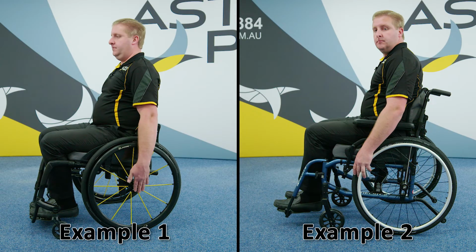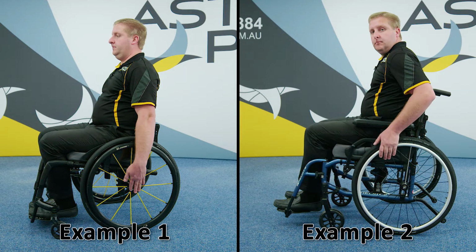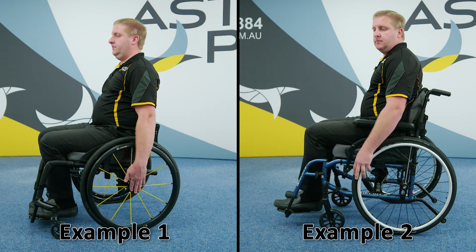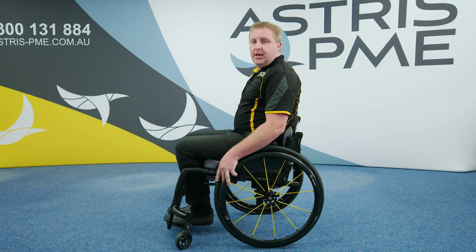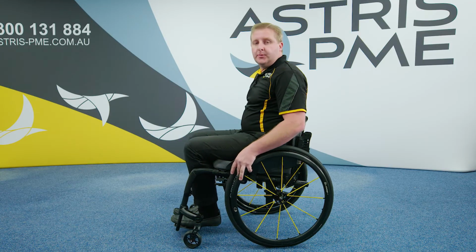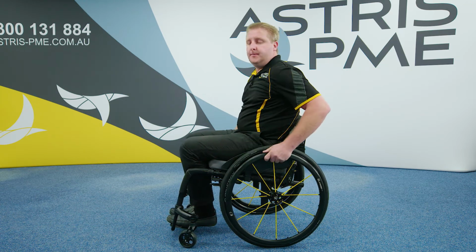The setup of this first example is this rear wheel position is in line with my trunk and my body mass. The setup of this second example shows the rear wheel is further back, therefore harder to reach and harder to push. To help wheelchairs be more stable laterally and easier to turn and push, camber is often used in the rear wheels of wheelchairs. Sometimes this is adjustable and other times it's fixed. Regardless, it makes the chair easier to turn and push. This wheelchair has 2 degrees of camber.